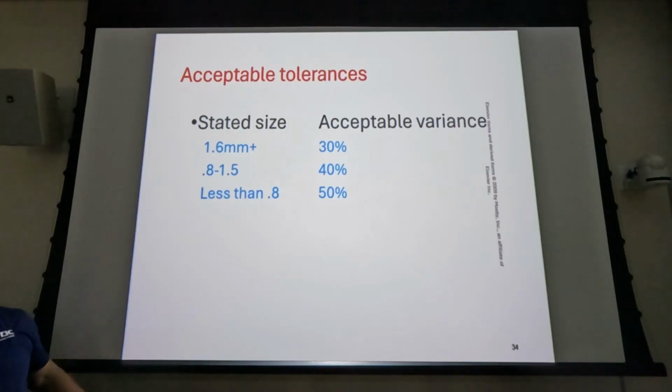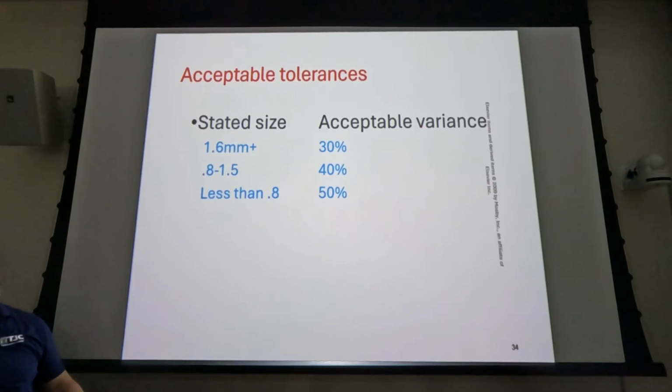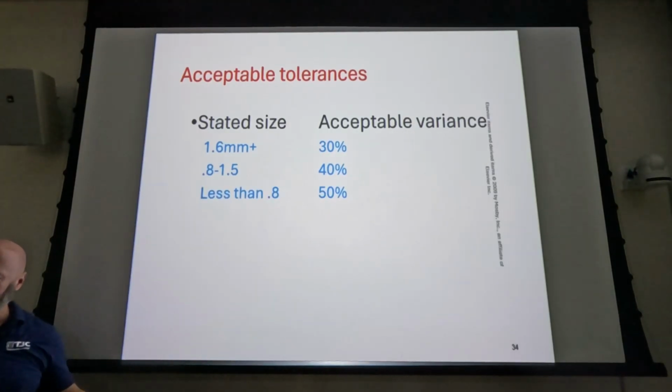All right, so notice though that the smaller the focal spot, the greater the variance, just because it's kind of hard to control. You stack trillions of electrons on a smaller focal spot within probably a larger focusing cup, and you make your exposure, they're going to spread out, right?